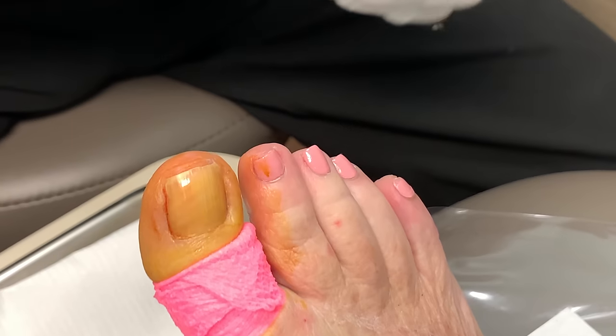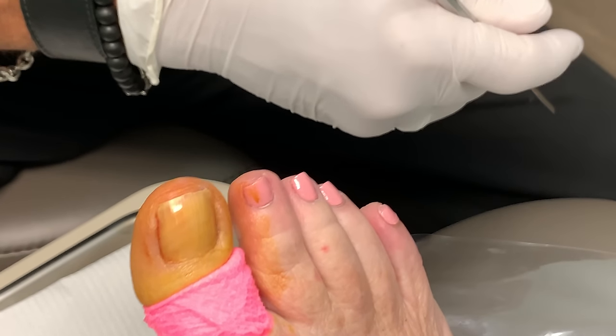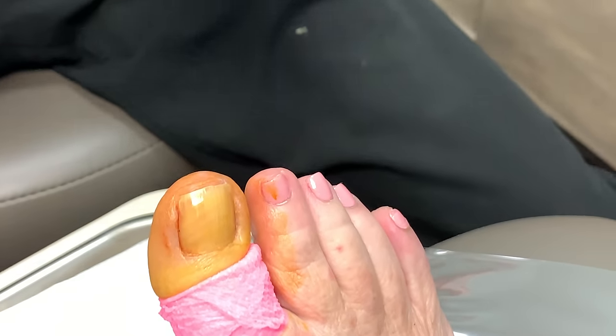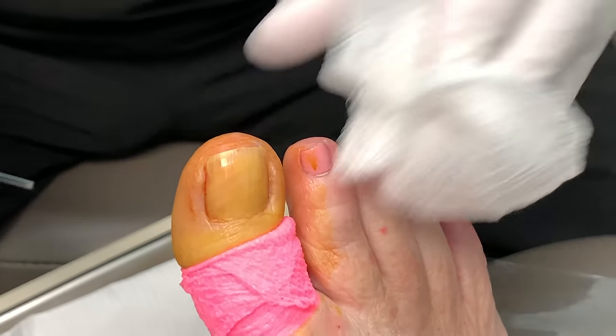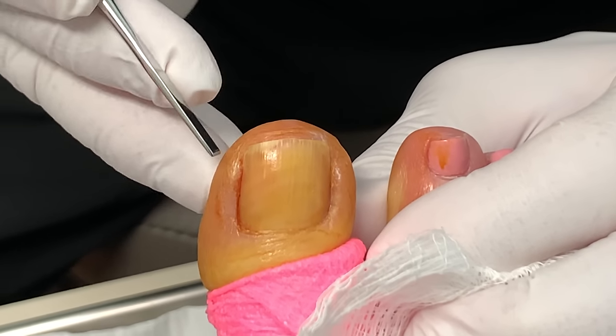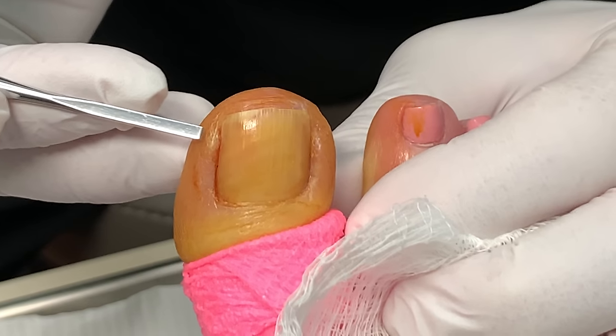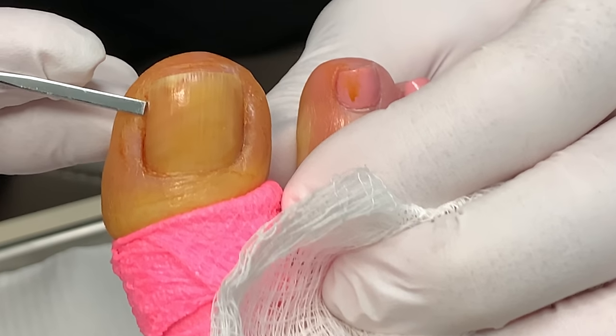The way we judge that is how loud the patient screams. If she screams really loud, we know it's not numb. If she screams sort of loud, we know it's kind of numb. So this side right here that we're doing — she told us this side does not hurt her. See that little hump there? Don't know if she bumped the toe or if that was from a pedicure.